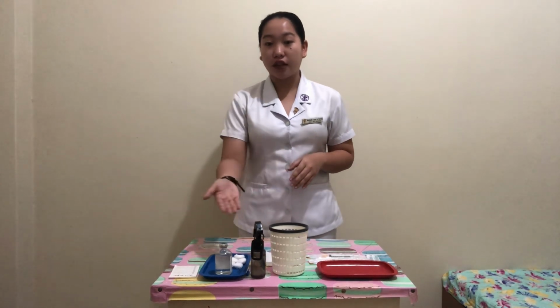So we have sterile water, which will serve as the medication vial used in this demonstration. And of course, we have a medication ampule. I have also a gauze pad, cotton balls, and a medication tray, and most importantly, a waste receptacle to dispose of used needles and syringes to avoid needle prick injuries. So this time, I'll be preparing the intradermal and subcutaneous vial medication.